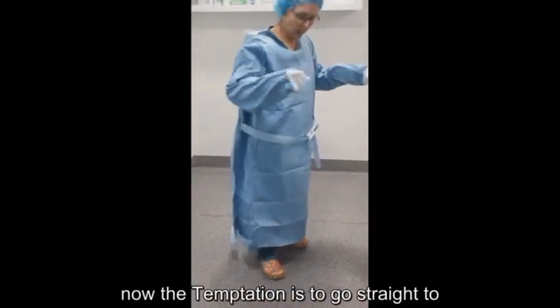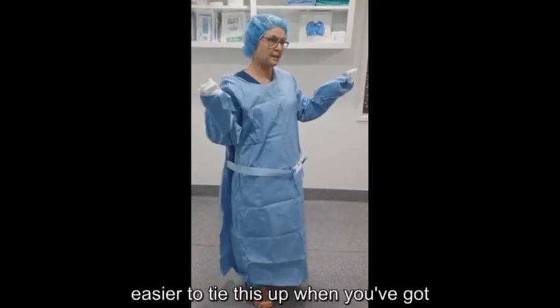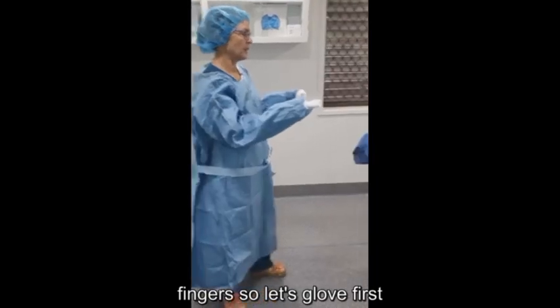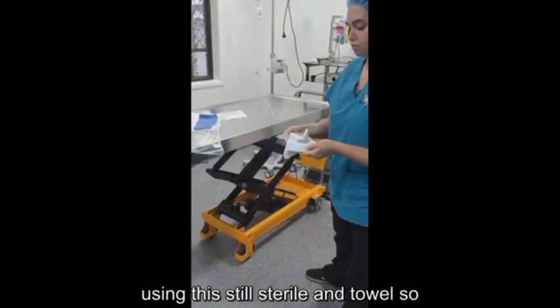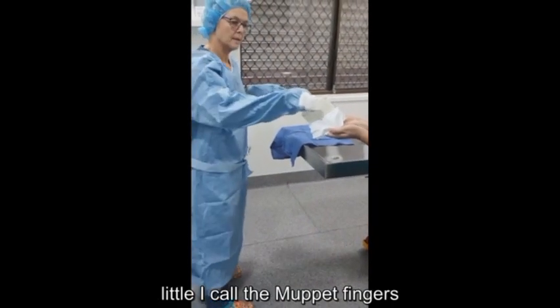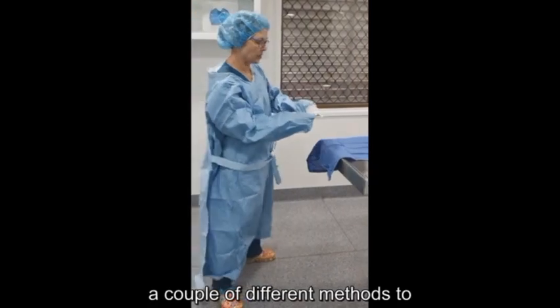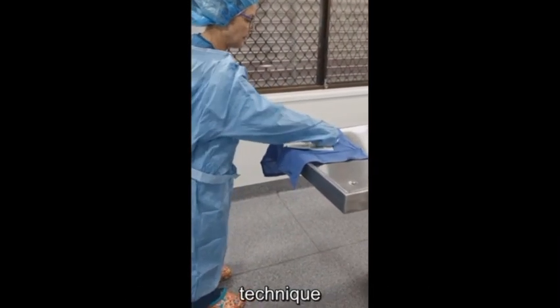Now the temptation is to go straight to here and tie this up, but it's a lot easier to tie this up when you've got fingers. So let's glove first. I'll grab the gloves and I'm going to be using this still sterile hand towel. So little, I call them muppet fingers, come over and grab the gloves. There are a couple of different methods to gloving. I'm going to use the closed gloving technique.